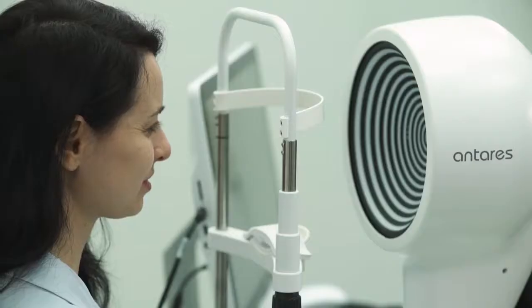It will recognize the eyes automatically from left eye and right eye, so we don't have a problem with that either. And I suggest that we get started on an actual patient.